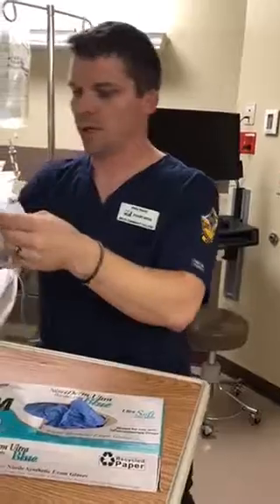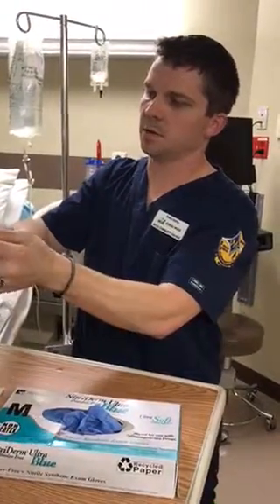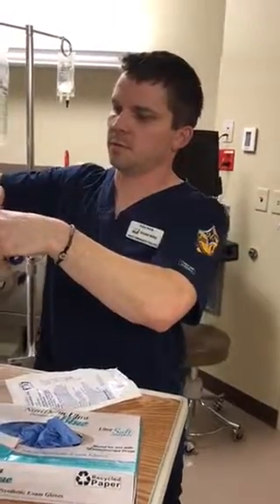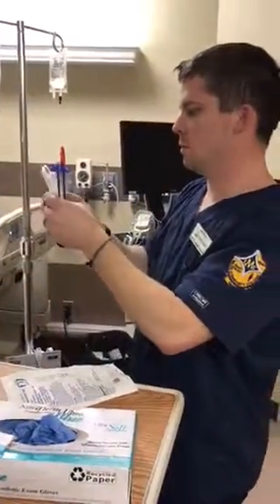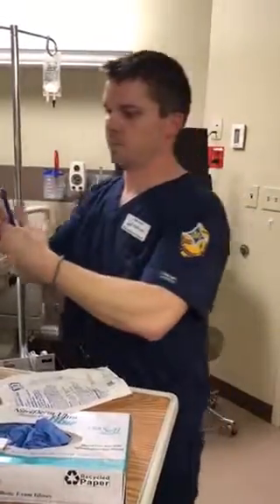I'm going to open a secondary medications set, which is 10 drops. I'm going to pop those off. Dispose of them.